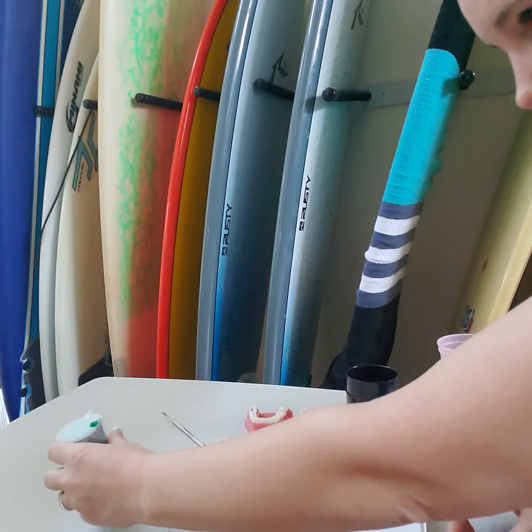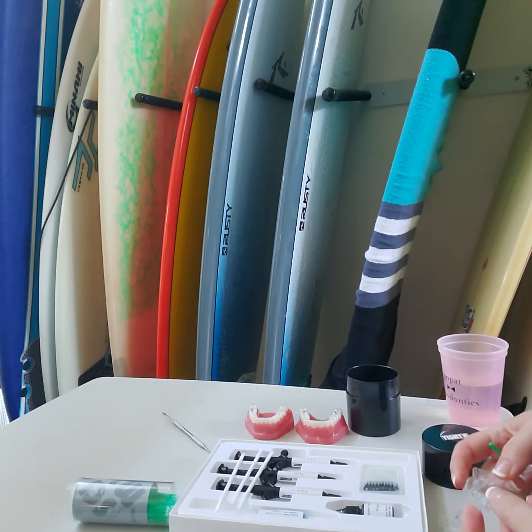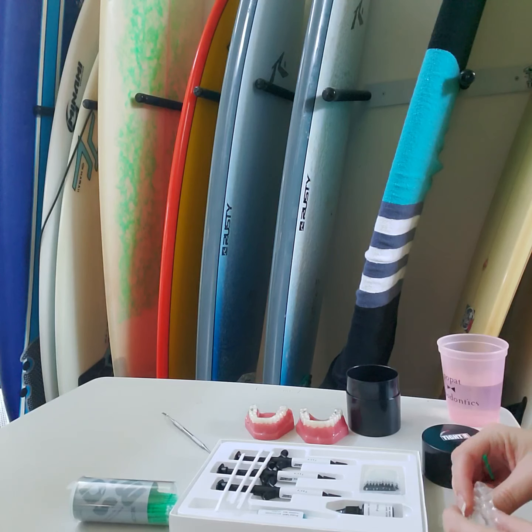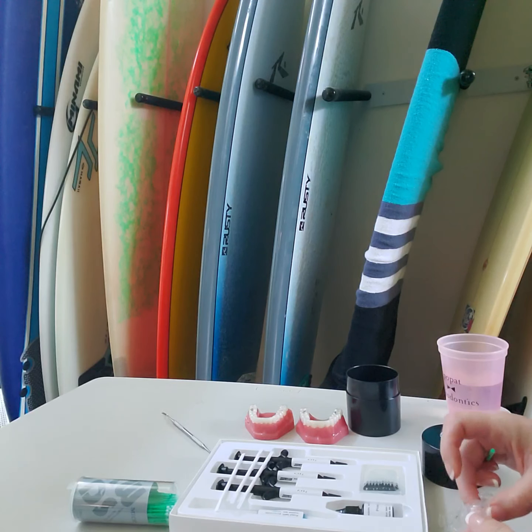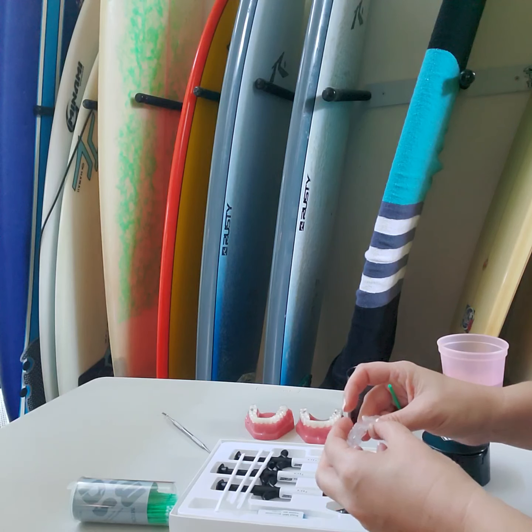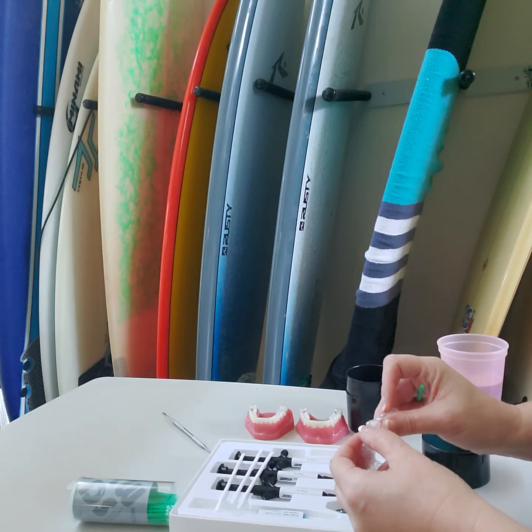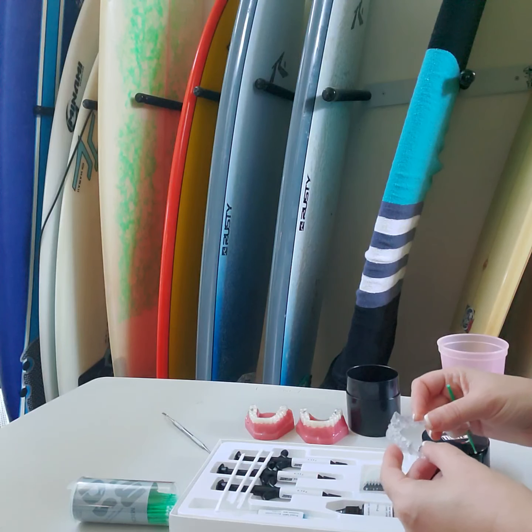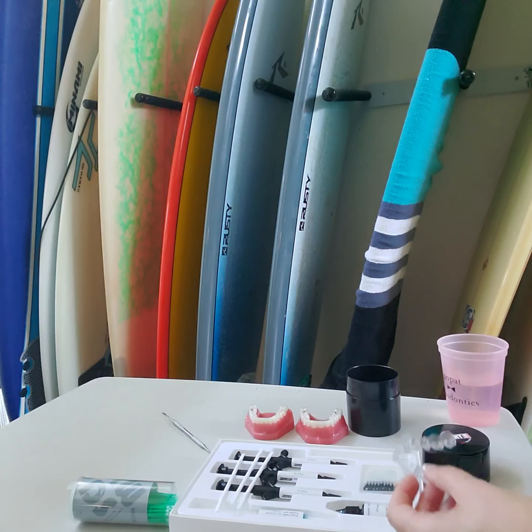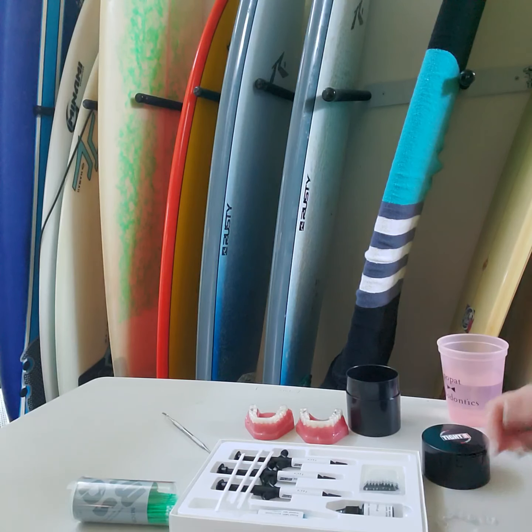So first thing you're going to want to do is make sure that you're looking at your treatment plan and you count how many attachments there are, right? So 1, 2, 3, 4 on this one, 5, 6, there's 2 on that tooth. There's 1 hiding, 7, 8, 9, 10. There's a fair amount on this one. And you want to double check on the actual treatment plan as well to make sure that you got them all, because they can be a little tricky to see, okay?